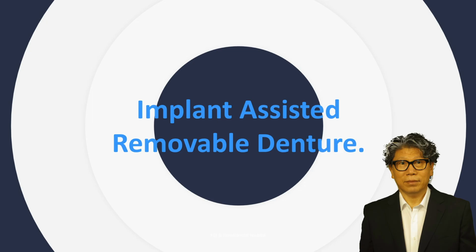In other words, performing AllonX treatment using only anterior implants without placing fixtures in the posterior region results in excessive cantilever formation and compromises treatment stability.